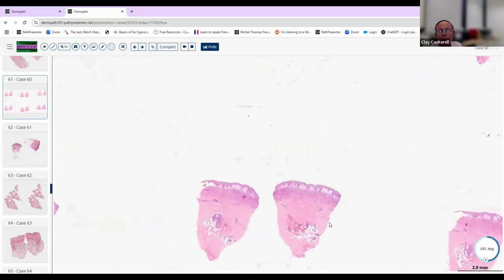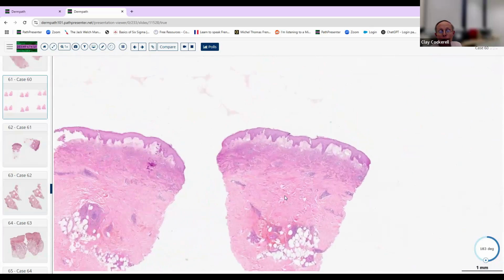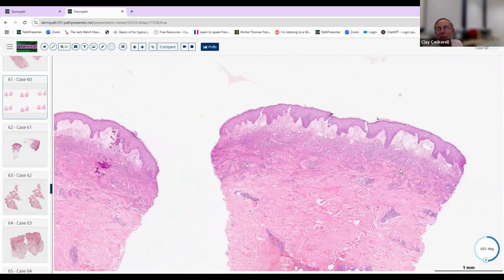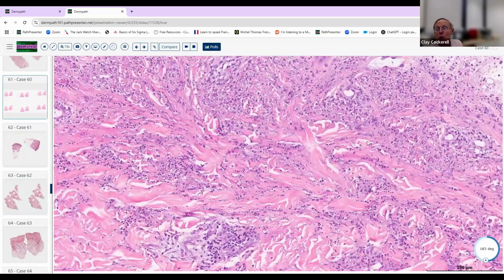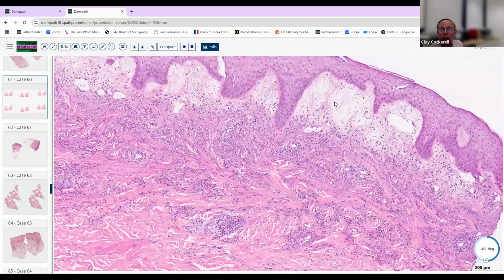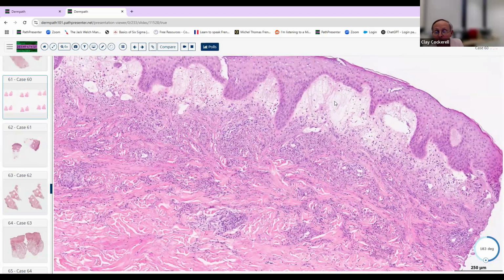This one, punch biopsy of a diffuse dermatitis, diffuse in the upper part of the dermis, and it's got this dense infiltrate superficially with this massive papillodermal edema. Hopefully you can appreciate even at this power that these are not lymphocytes once again. As we go to higher magnification, they're all neutrophils. Tons of polys with papillodermal edema. That diagnosis is Sweet's disease.